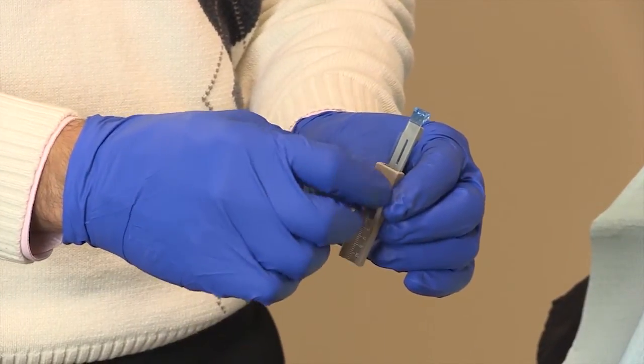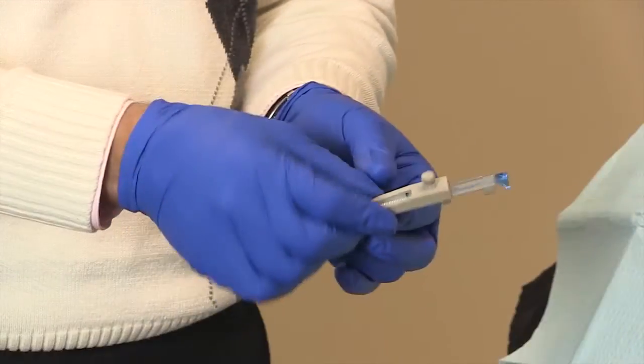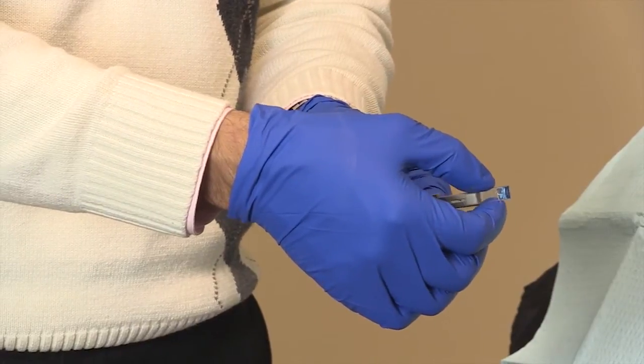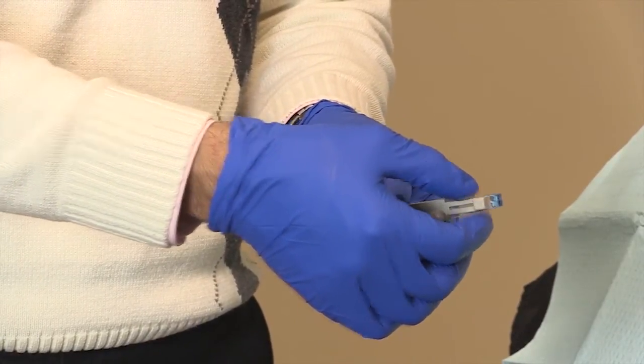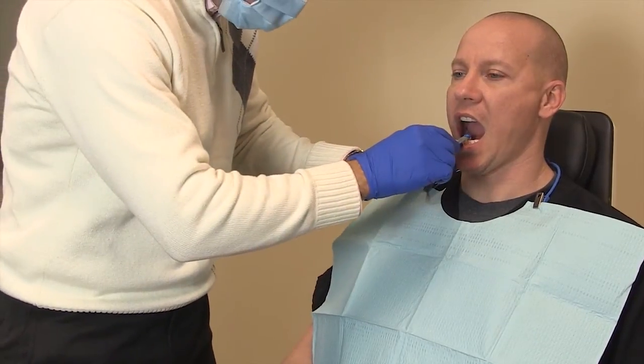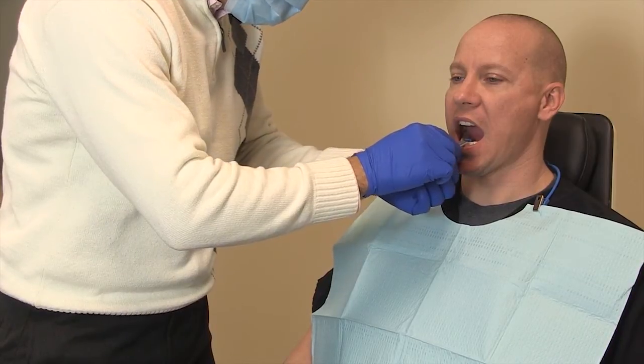the top to retain the 5mm bite fork. The lower knob is used to adapt the unit to the mandibular incisors. You can see here how this lower blue component is mobile and moves freely over the lower teeth. Once the lower is adapted, we move on to the upper.